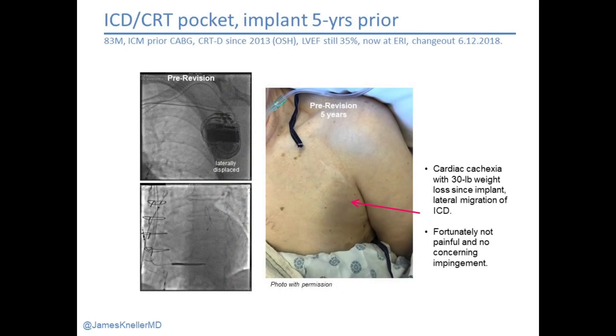Here's an 83-year-old man, ICD-CRT generator change referred to us — five years out with cardiac cachexia. He has lost 30 pounds, and as we see a lot in heart failure patients, with that lean tissue loss his pulse generator has migrated laterally and there is now lateral impingement. Luckily it is not uncomfortable for him, but he's certainly aware of it. This is one reason — particularly in heart failure patients — where we really try to anchor that generator medially to the muscle, so that as the patient's disease trajectory progresses they don't have lateral slippage of the device, which can be uncomfortable.